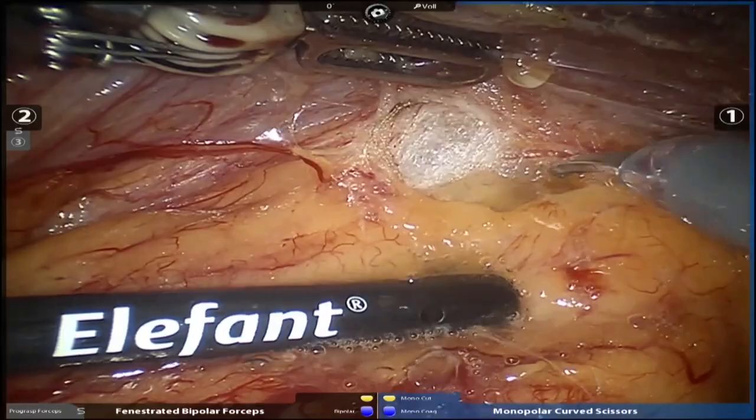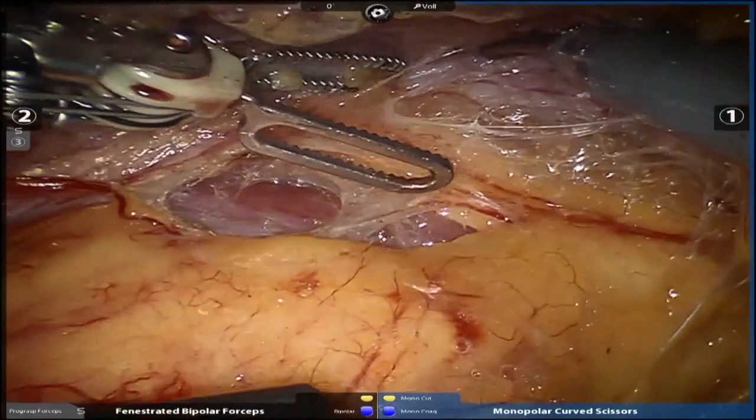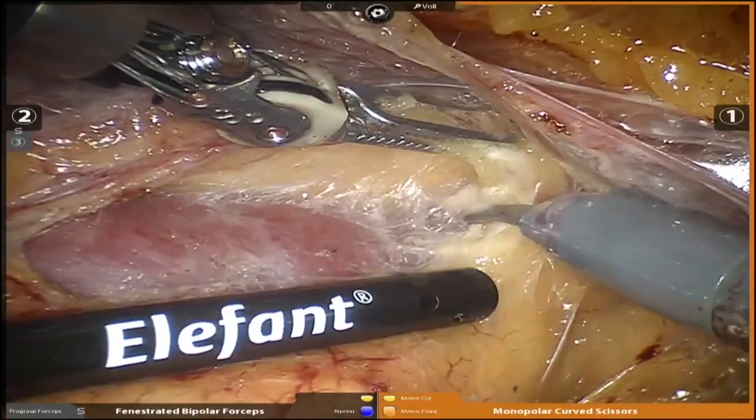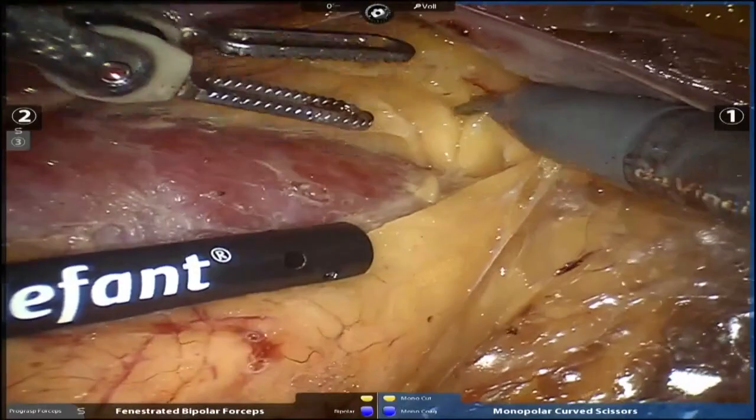I think for the beginner in retroperitoneal approach, once the peritoneotomy happens, it can be somewhat stressful. But it's not the end of the case. The fourth arm can really help. Right, and that's what you've got to remember. You make a hole in the peritoneum, it's not going to be as great a space, but you can still do the operation. So, you know, press on.